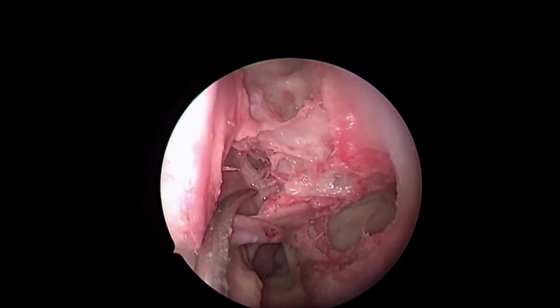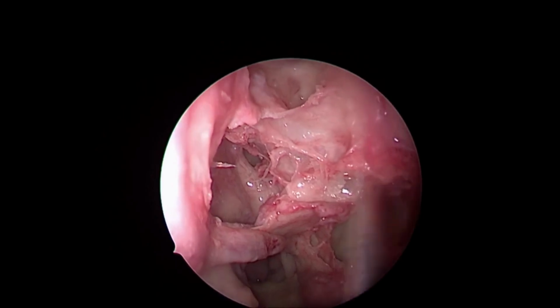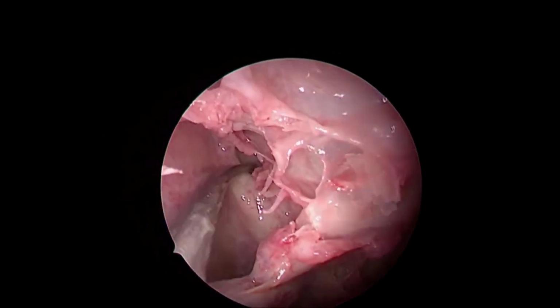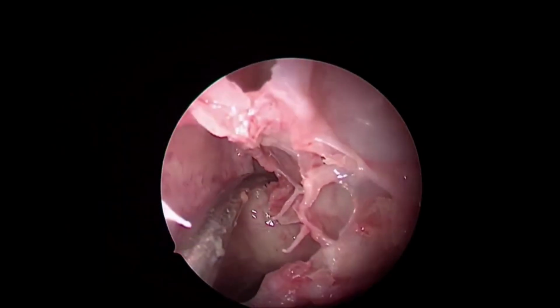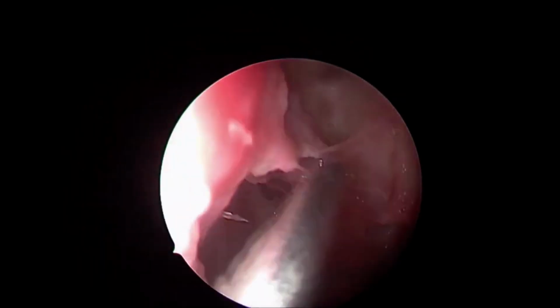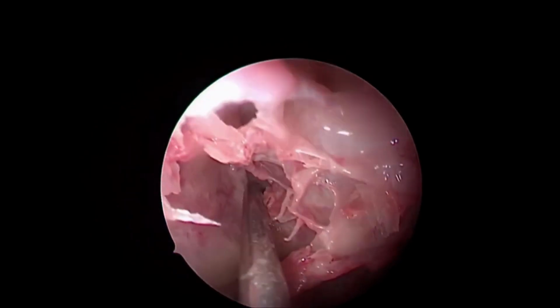At this point on the line, you enter into the ground lamella, and taking this line into consideration again, along the septum you look for the sphenoid. In any given situation, whether it is an Onodi cell or whatever, this entry into the sphenoid close to the septum is always safe.